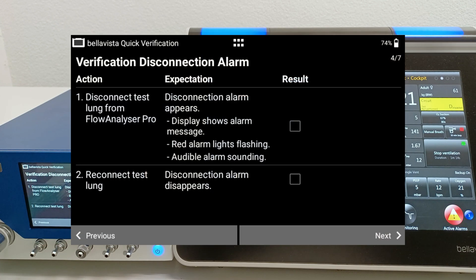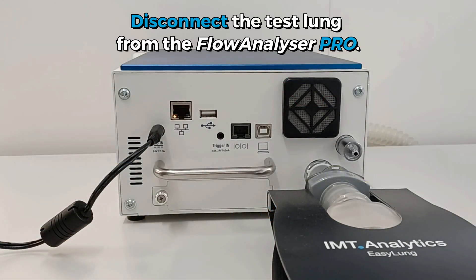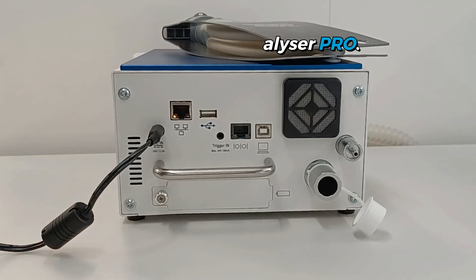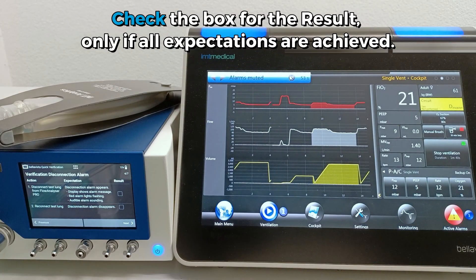Verification Disconnection Alarm. Perform Action Number 1: disconnect the test lung from the Flow Analyzer Pro. Then check the box for the result only if all expectations are achieved.